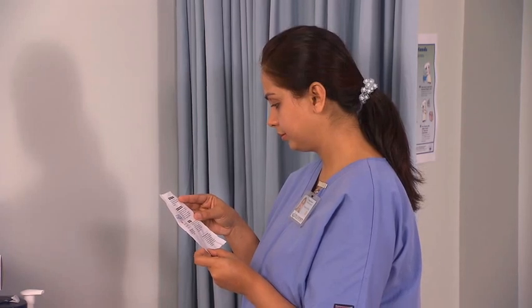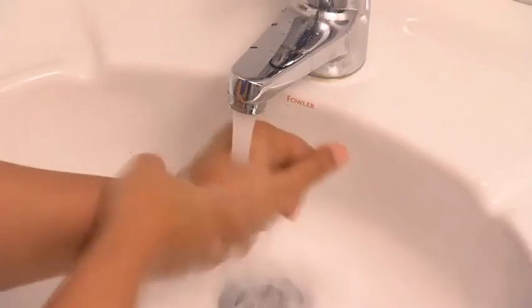Familiarize yourself with the medication details. Wash your hands and put on gloves.